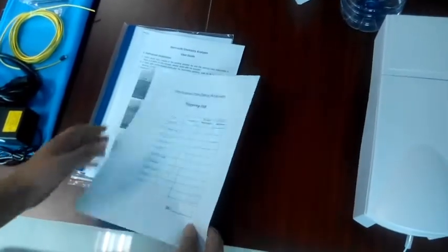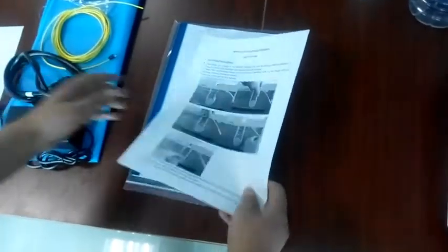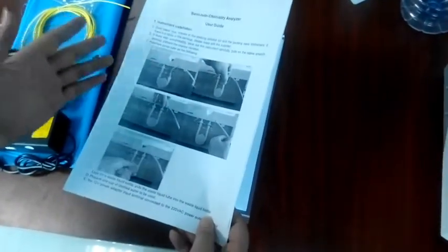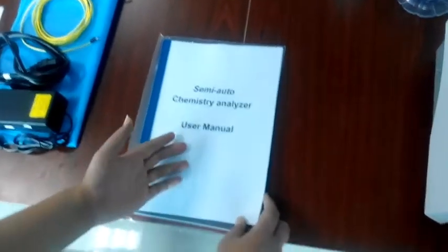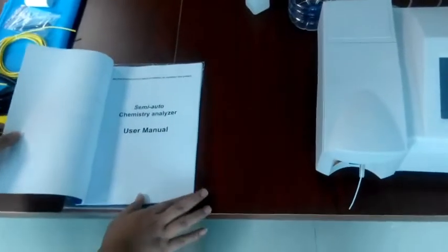There are three documents here. The first document is the packing list — from here you will see all the spare parts. The second document is the user guide, which introduces how to install and how to test using this machine. The last document is the user manual, which contains detailed information and answers to questions you may encounter during testing.